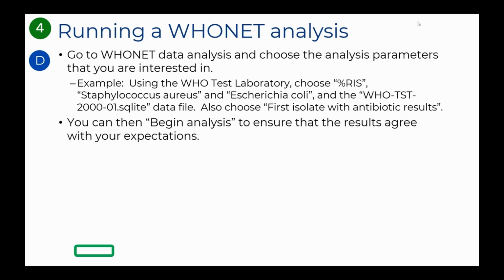To create a macro, the first step is to choose your analysis parameters. In this example, I will create a new analysis.